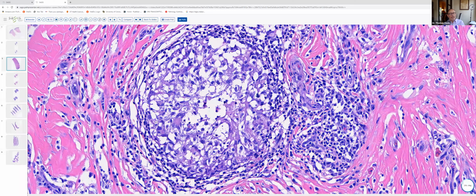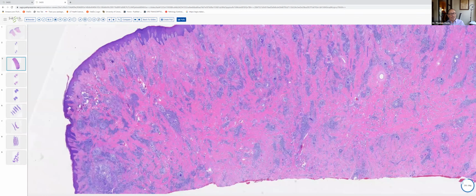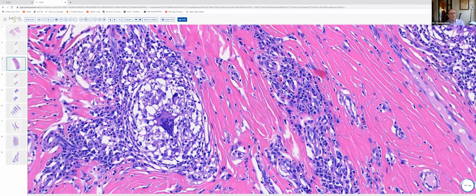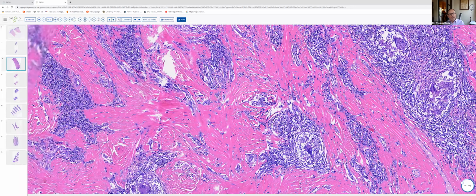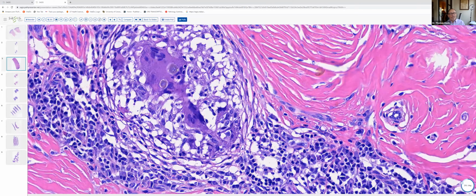Now I'm going to back out and go over to the left side of this particular biopsy specimen. And I'll zoom in slowly so we don't get any pixelation. And again, you can see we've got these multinucleated epithelioid histiocytes. But as you looked around here, within the cytoplasm of some of these epithelioid histiocytes, hopefully you were able to pick out the spherules of coccidioidomycosis.